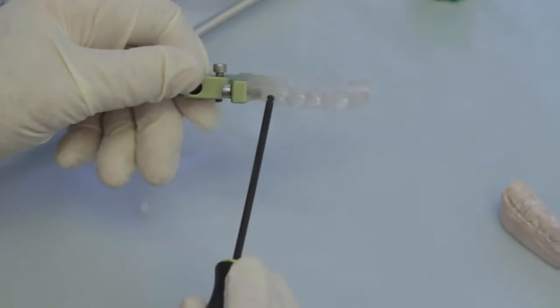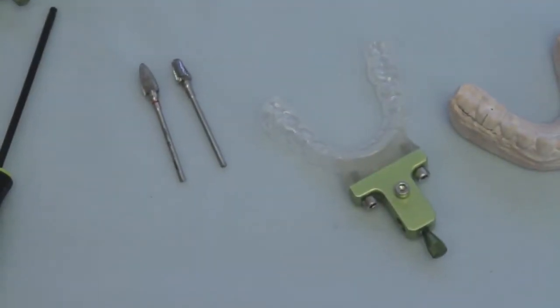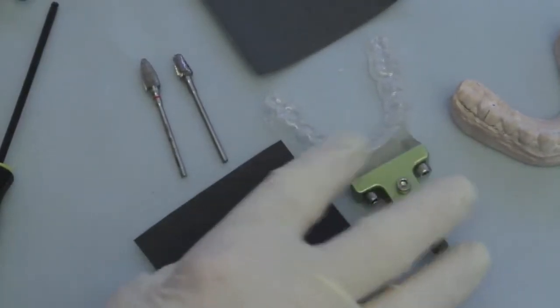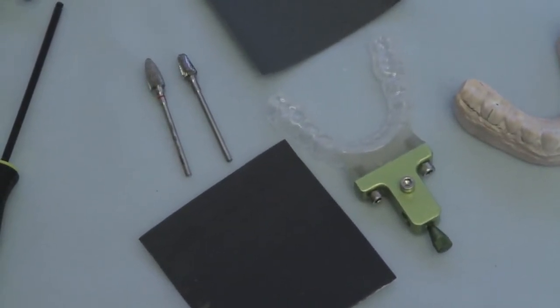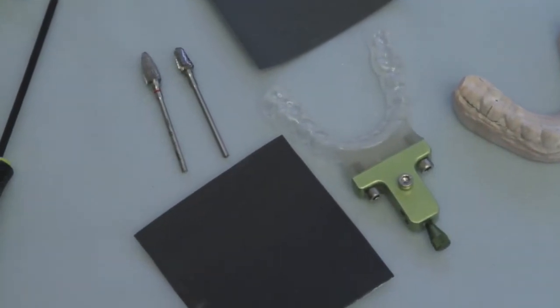To accomplish that, after this is set, I would use carbide double crosscut burrs, leave a nice smooth surface, and then you can use some wet and dry sandpaper, and you can make this very, very smooth so the patient has a very positive reaction. And so that's the way you make your lower clutches.